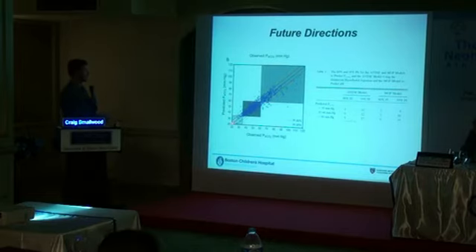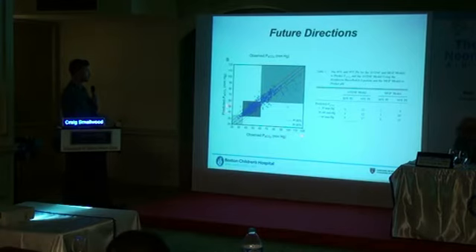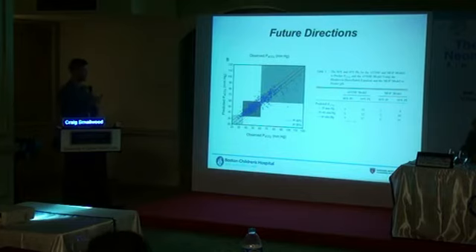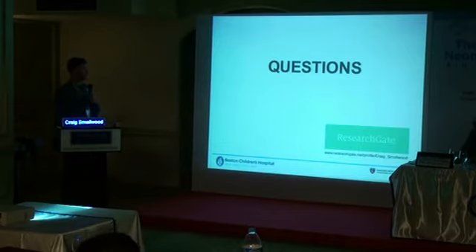I think the general sense is that these red dashed lines should be really close to this black line, which is where you'd like to see all these little blue circles. So they have the actual CO2 here, and their methodology here of predicting PaCO2 based on some risk factors they looked at in the medical record of the patient. And you can see the performance is really not that strong. So what this means to me is a little bit encouraging because there's some work to be done, but I think that's where you'll see myself and my colleagues moving to support you guys in that way. And that is it. Thank you so much.